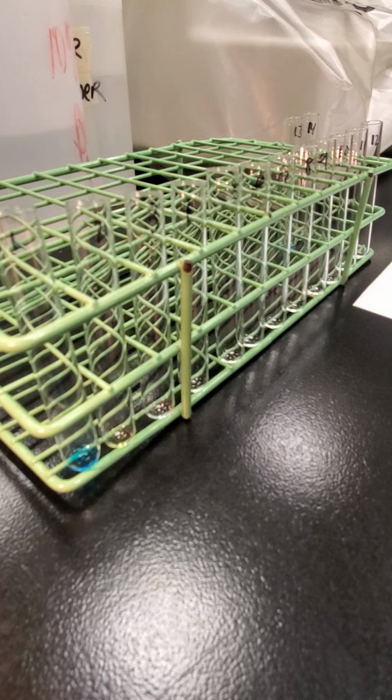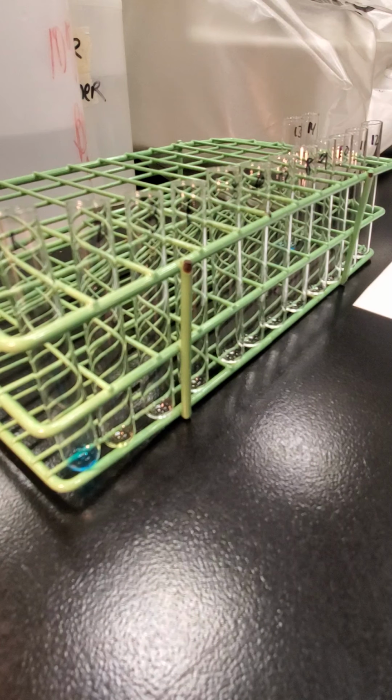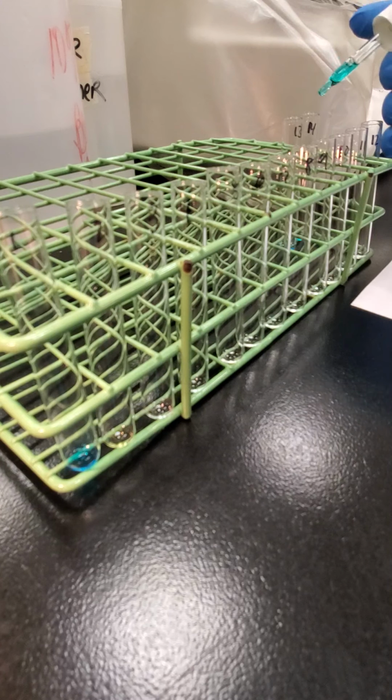Okay, and then I need 2 drops of polyspecific AHG to tube 14. This is our polyspecific reagent. It has IgG and C3. So I'm going to add that to tube 14, 2 drops.